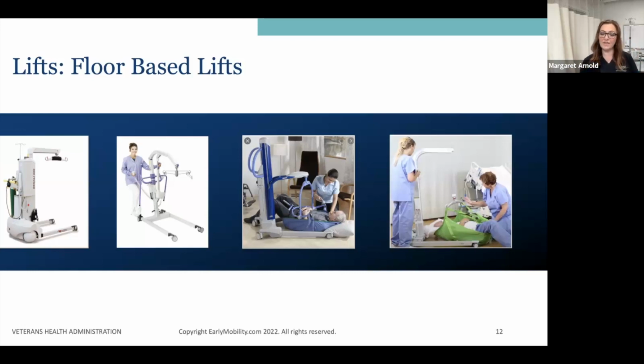You also want to look at the hanger bar. You'll see on these different lifts, the first one has a 2-point loop style hanger bar that we just talked about. The second one has a 4-point hanger bar that can be converted to a 2-point by taking the side attachments off of the main 2-point spreader bar across the middle.